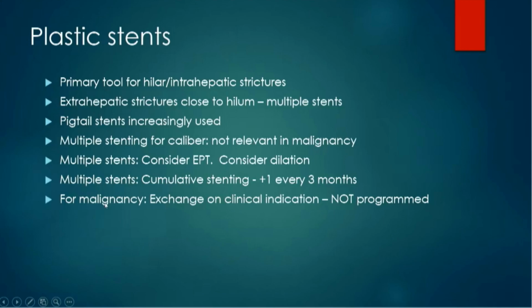So for malignancies, we never do programmatic exchange of plastic stents because the duration of them is so variable, and in the occasional patient, they can last 6 months or more. So we never take these patients back for programmed stent exchange.